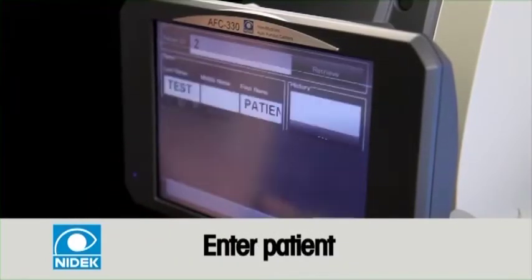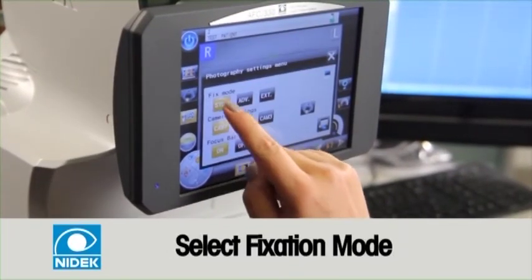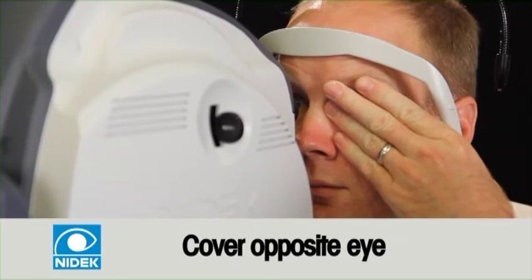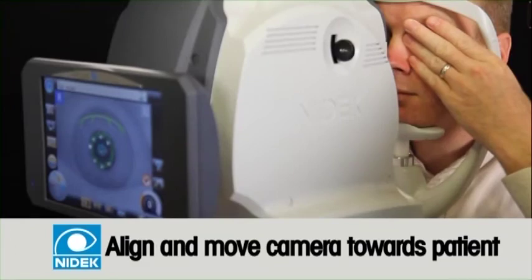Enter patient demographics. Then select Panorama icon. Select Parameter Settings. Select desired fixation template. Align patient and have them cover their opposite eye. Move the camera towards the patient and instruct them to look directly at the flashing target.